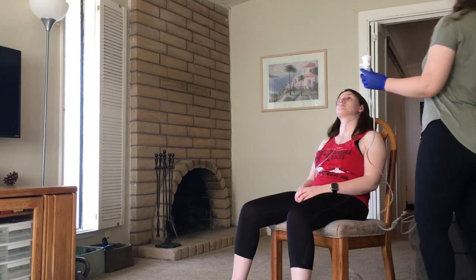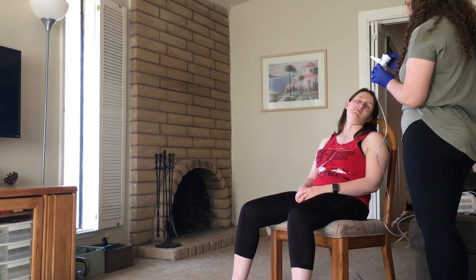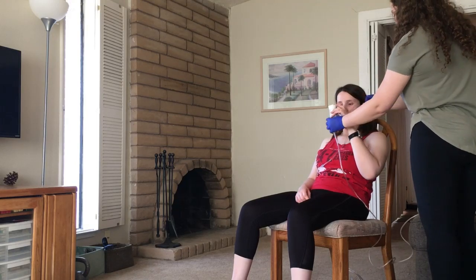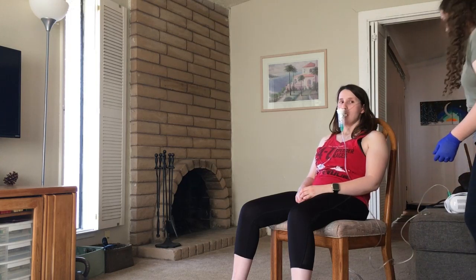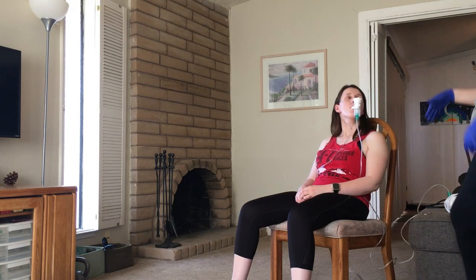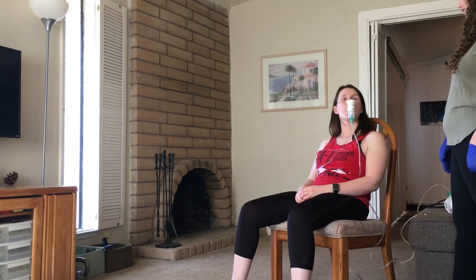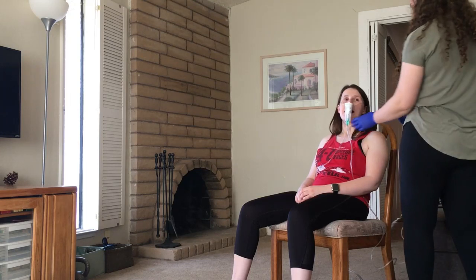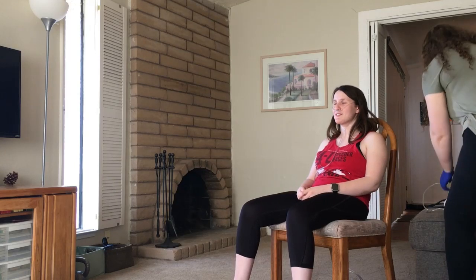Alright. You just put your mouth around the mouthpiece there and breathe in the medication. It'll be for 10 minutes. Breathe slowly and evenly. In and out, deep breaths. Want to get as much of the medication into your lungs as possible. Alright, you're good. 10 minutes passed. Yeah, that was the fastest 10 minutes of my life.